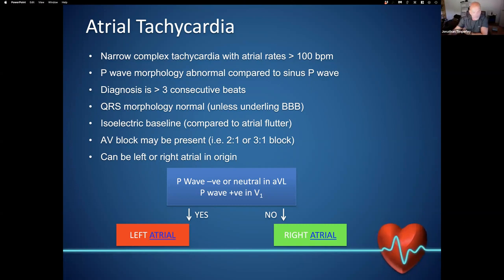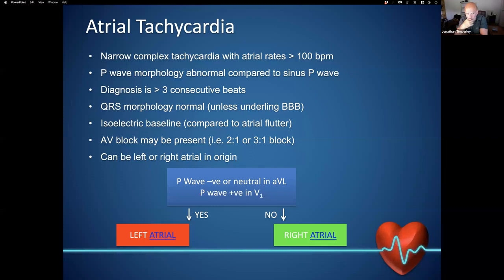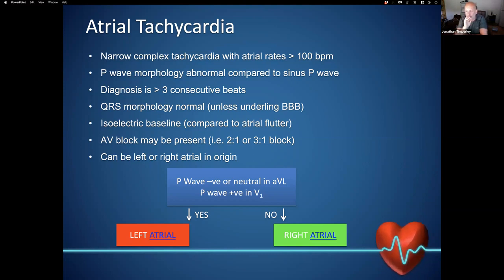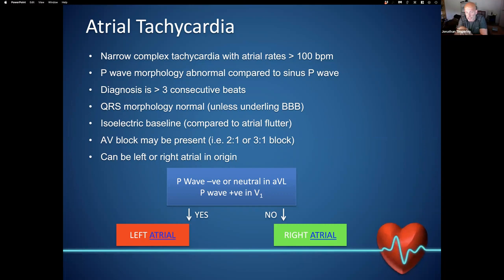Atrial tachycardias are a narrow complex tachycardia, by definition with rates over 100 beats per minute. The P wave morphology is very much determined by where in the atria the origin is. Diagnosis requires greater than three consecutive beats, and the QRS morphology should be normal unless there's an underlying bundle branch morphology. We expect an isoelectric baseline, compared to atrial flutter where we never have a true isoelectric line. Whereas with atrial tachycardia, there is an isoelectric line with a P wave morphology that occurs intermittently.